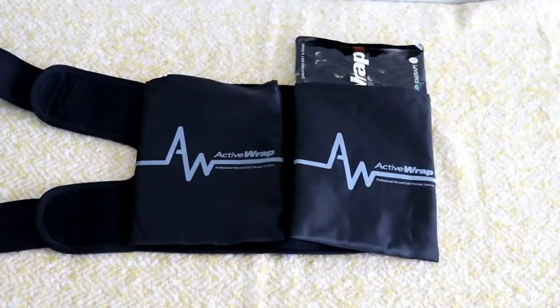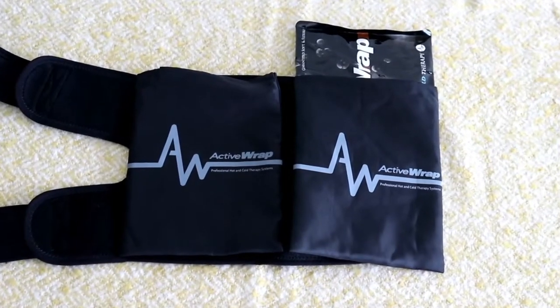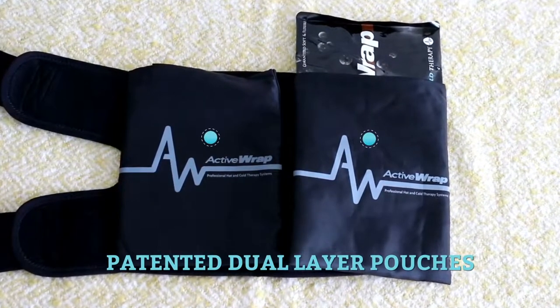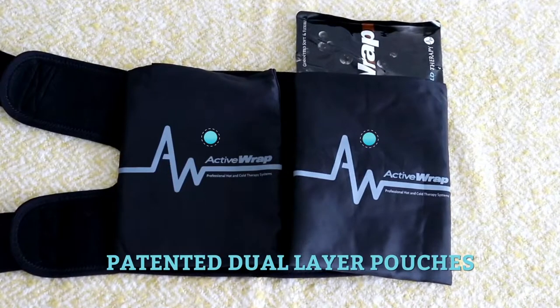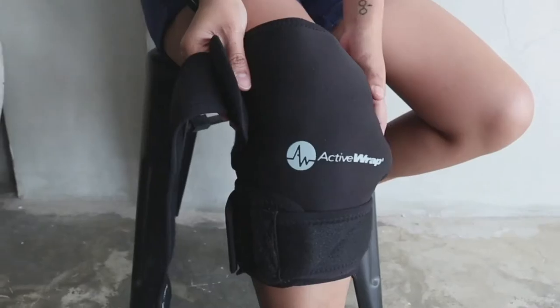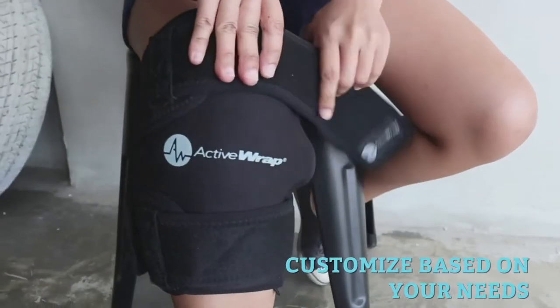Here you'll see the Active Wrap advantage. The detachable pouches are patented dual-layer pouches. By placing the hot or cold gel packs in between one or two layers of material, they help control temperature and comfort levels up to five degrees. The pouches are detachable, so you can customize your Active Wrap based on your needs.